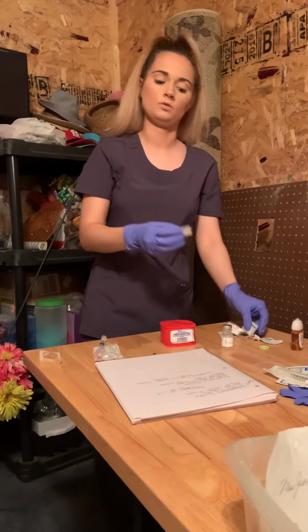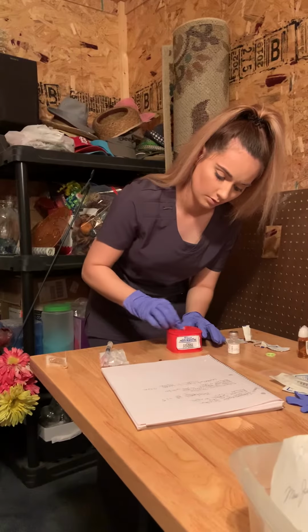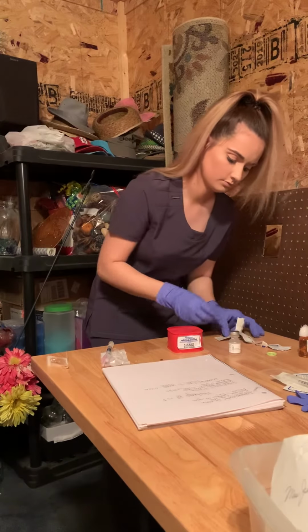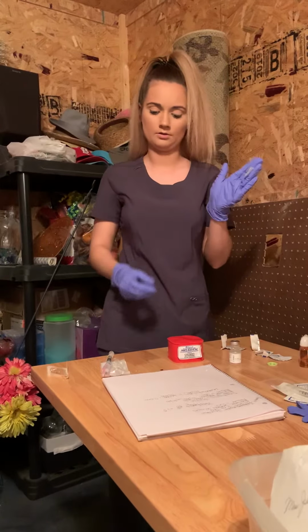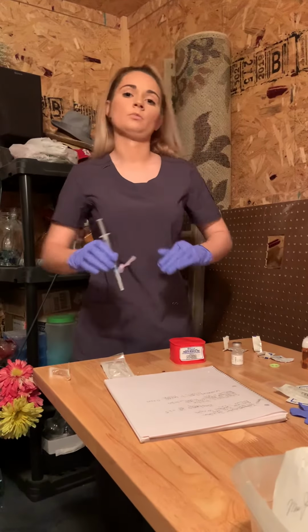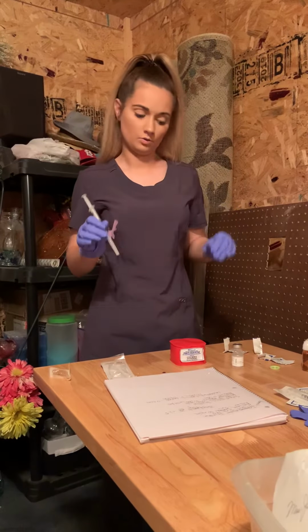To clean the site, you want to take your alcohol swab and go from the middle all the way to the outside, at least 2 inches in a circular motion. You want to get your alcohol swab or your gauze, put it in your non-dominant hand. And for this, we are doing a Z-track method. You will not use the Z-track method if you are doing it in the deltoid.